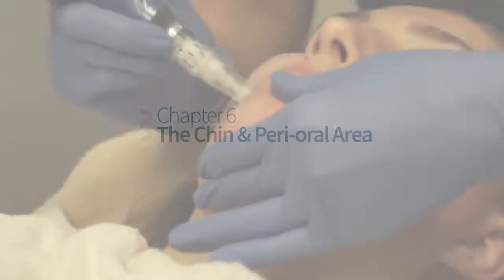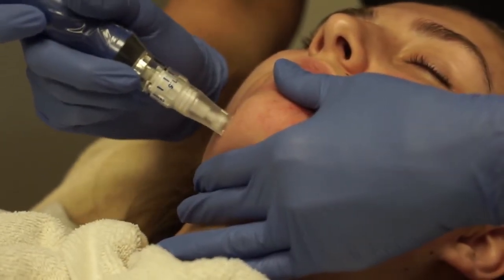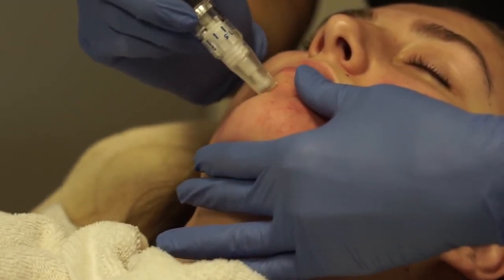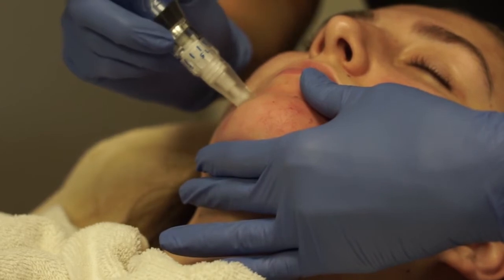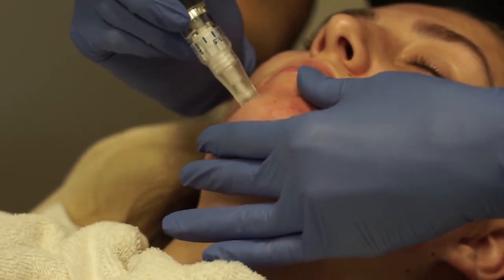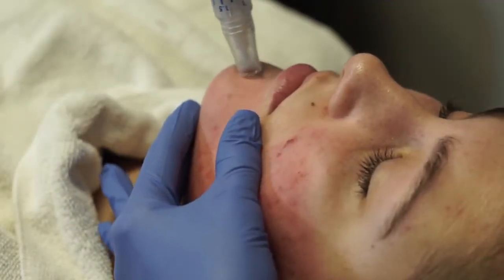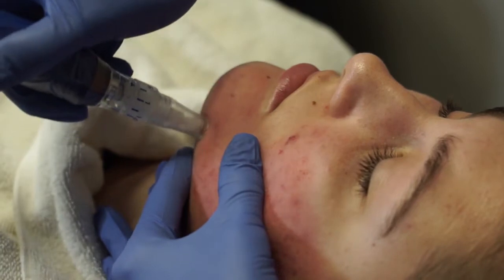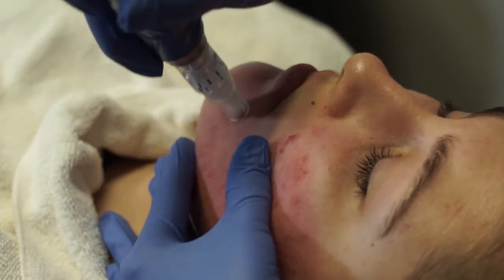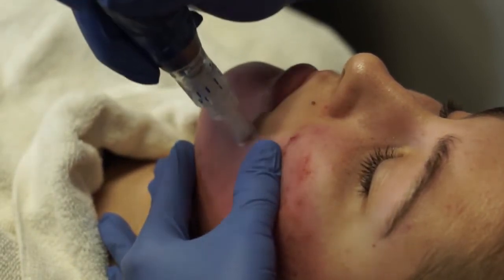The chin and perioral area. Once the right cheek is complete, move to the chin area. If you have not already done so, add lift hydrogel to this area prior to treating. In this patient's case, the depth setting of 0.75, which was used on the cheek, was sufficient to achieve the desired result, and there was no need to increase or decrease the depth for this area of the face. Complete the right side of the chin using vertical and horizontal passes, then small circular motions, as seen here, being careful to avoid moving inside the border of the lip.